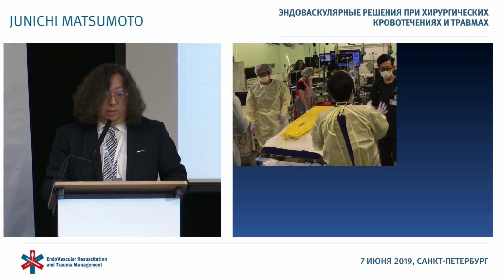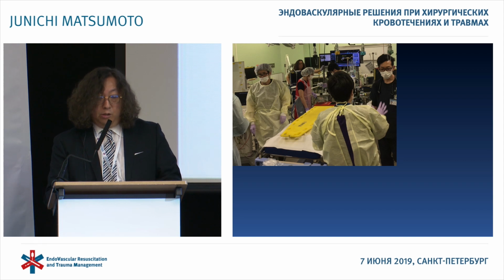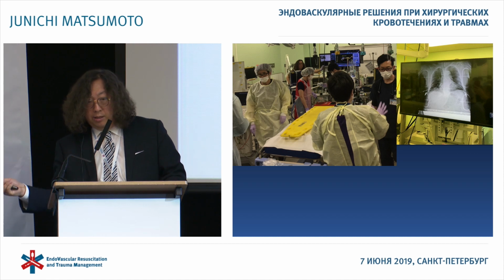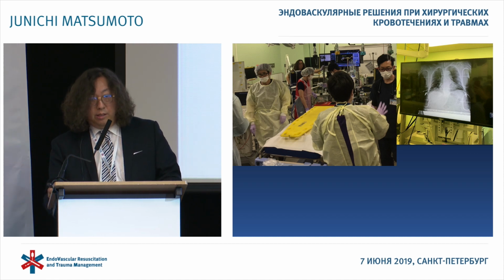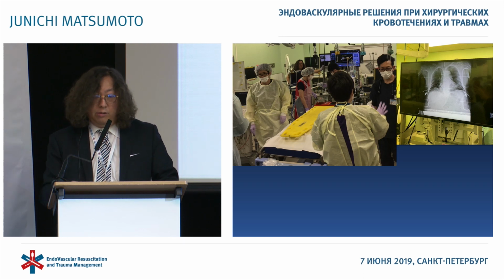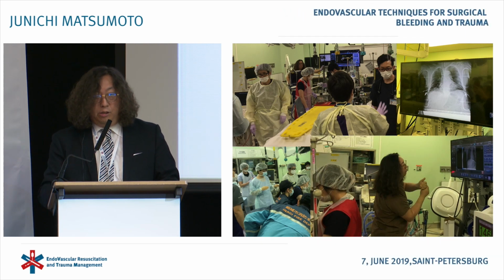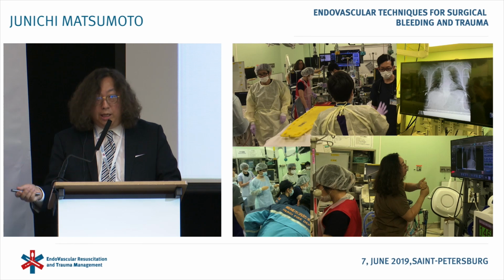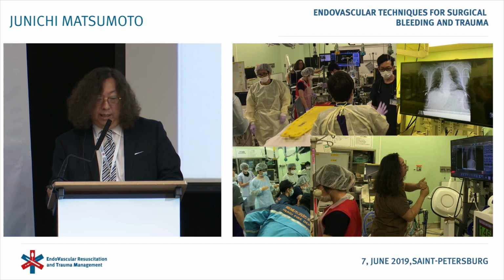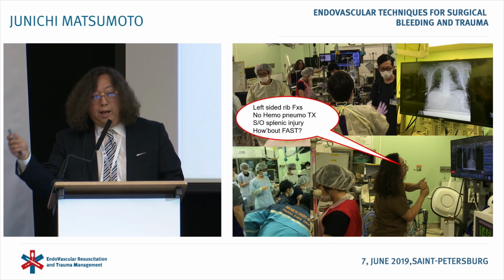And yes, here you can see me waiting for the patient next to the monitor. We have monitors near the head of the patient, and we share the images within the team during the primary survey or secondary survey. When we get a patient, my job is to evaluate images immediately, or almost at the same time as the images are obtained. And we say, this chest X-ray obtained.